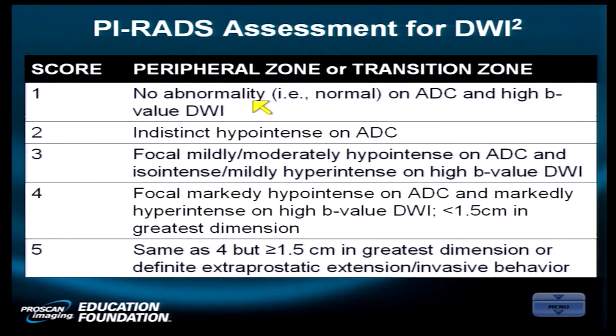We have no abnormality whatsoever on the diffusion-weighted image. Now let's talk about the diffusion-weighted image for a second. How do you make the diffusion-weighted image? You start out with what we call a reference image.